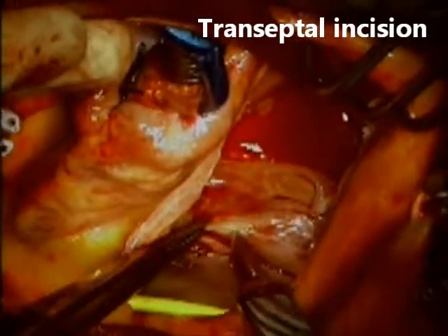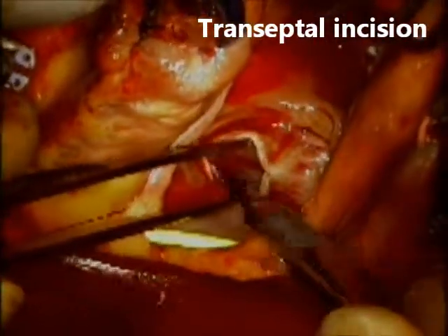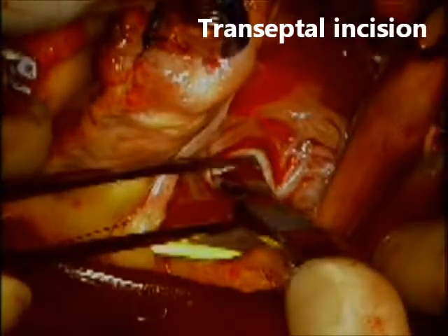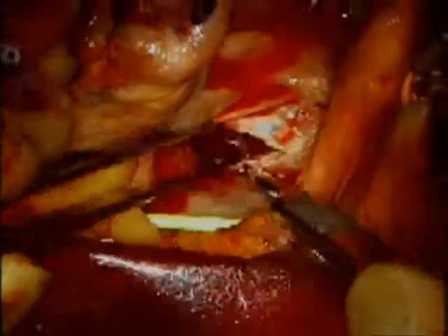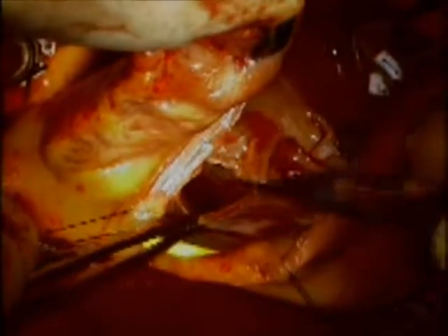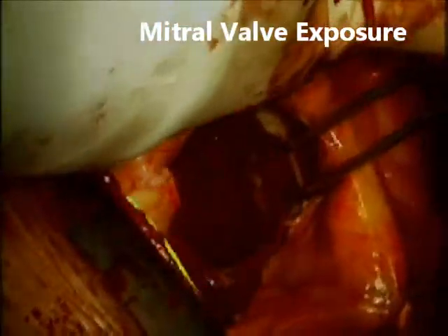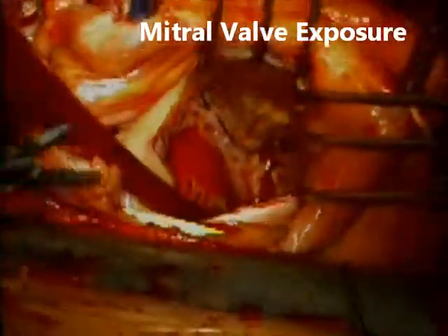Once the tricuspid valve is repaired, I proceed with a transeptal incision. You have to make sure to use just the tip of the number 11 blade because you don't want to create lacerations in the back wall of the left atrium, which might be very close to your septum. I start from the limbus and cut through the area where the small PFO was, so that when we close this transeptal incision at the end of the case we will eliminate the patent foramen ovale. With a large left atrium and this type of incision, your exposure of the mitral valve tends to be excellent.